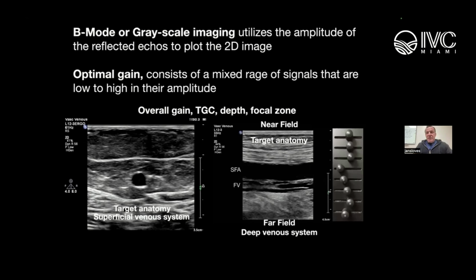It is. Yes, in my opinion, if you're doing this correctly, your hand is always on the controls, changing exactly what you're seeing from image to image as you go about this and acquire this data.